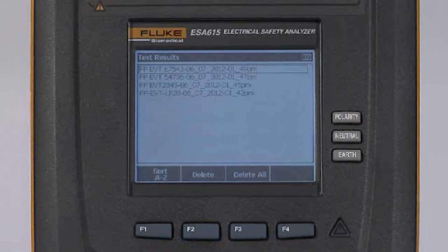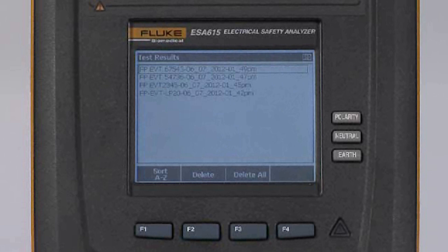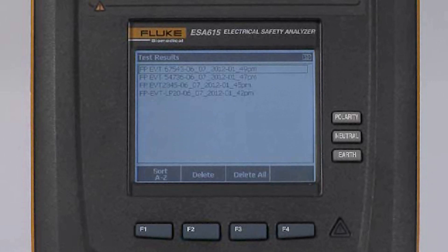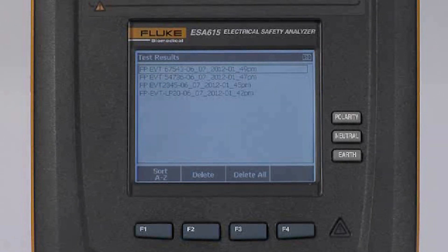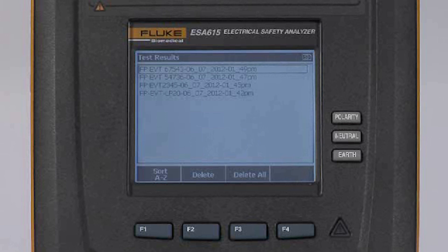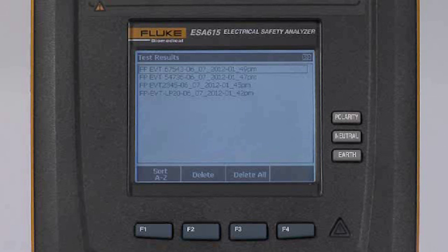The F1 button allows me to sort them in alphabetical order. The F2 button allows me to delete the test result that I have identified.